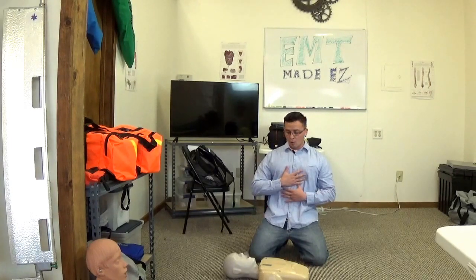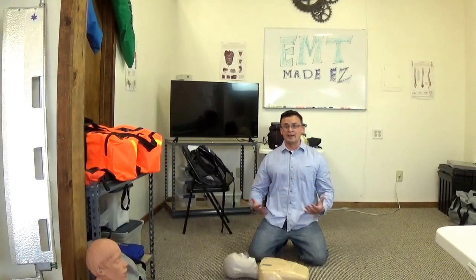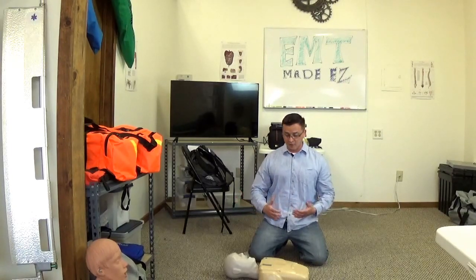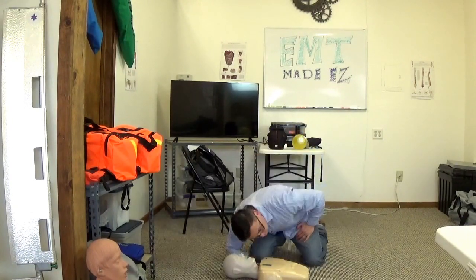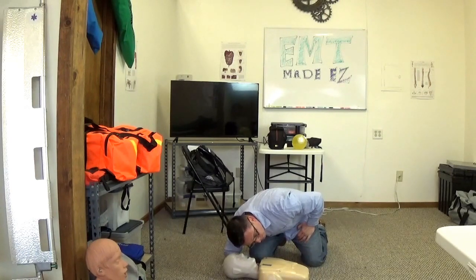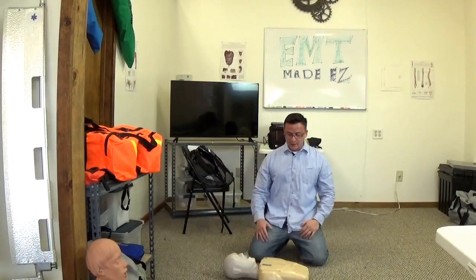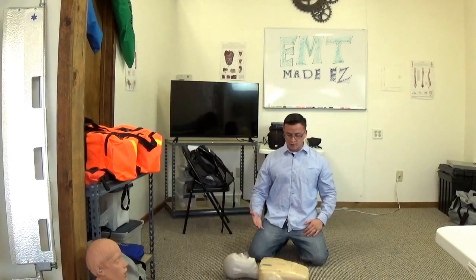As the EMT, I am now going to call for additional resources. I can always cancel if I don't need them, but I am going to get an extra unit on scene just to be safe. And I am also going to check for a pulse and breathing. [Counts 1-1,000 through 7-1,000.] The proctor is now saying: your patient is apneic and there is no pulse present.